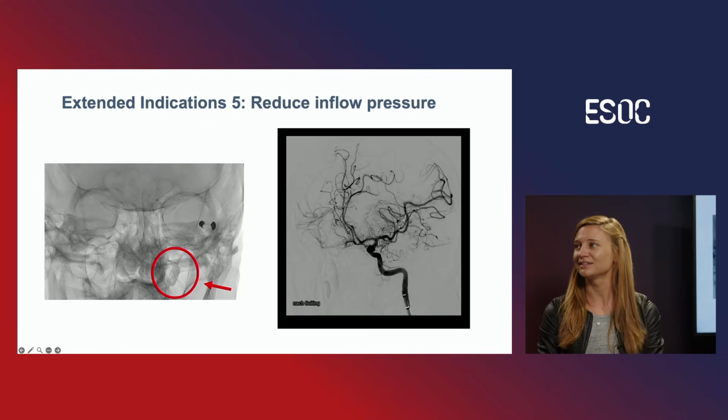No, I think this is a very important aspect of the balloon guide as well, and we discussed that in our team as well. As soon as you have a perforation, the fastest thing you can do is just inflate the balloon, and you lower the pressure already, and then you have more time to think how you solve this problem of a perforation. If you don't have a balloon guide, you want to act fast, use a temporary coil or use a neuro balloon, but that takes time. Or press. That's true, you can press the carotid, that's another thing. But this is so easy, it goes very fast. So yes, it's a very nice example how you can use a balloon guide to help you in these complication situations.